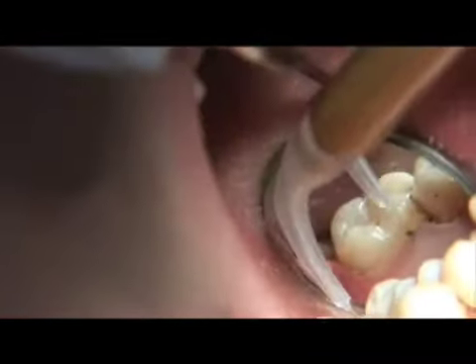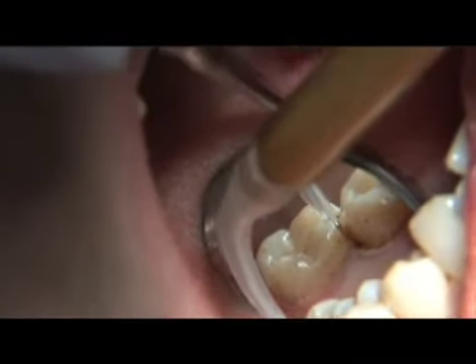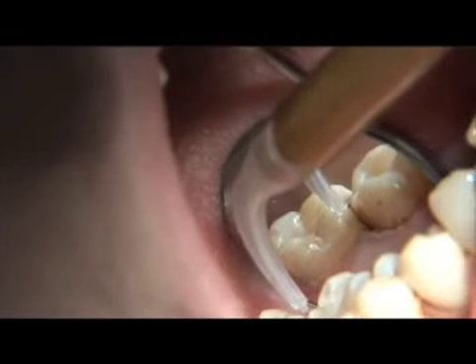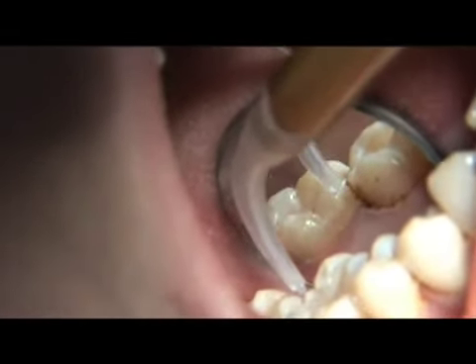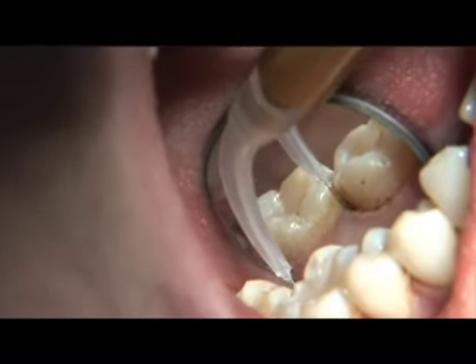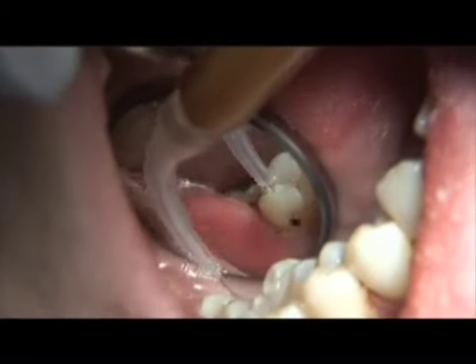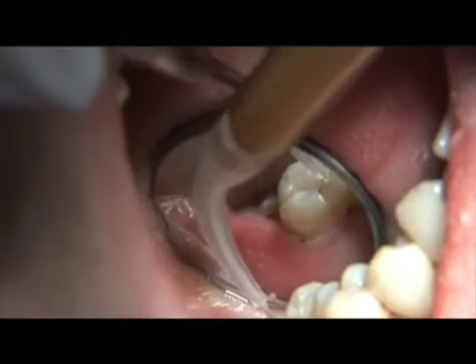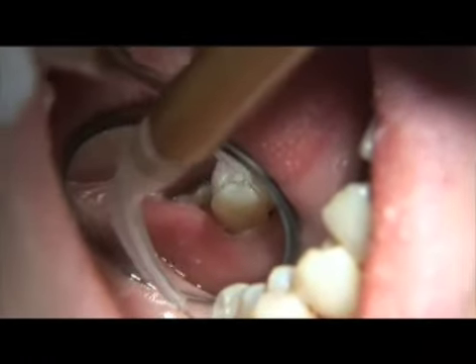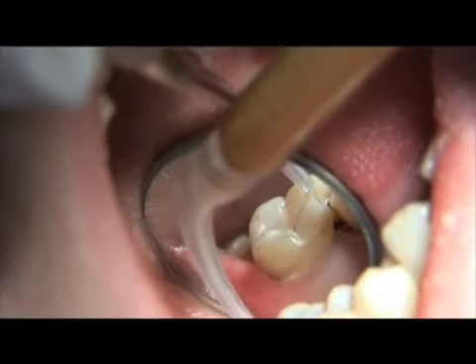Laser curettage will take up to 10 minutes per quad of the periodontal therapy appointment. It will take 30 to 45 minutes if one is doing the entire mouth at one appointment. Because the laser fiber is so small, treatment access is made easy, even in the most challenging areas of the mouth. Be sure to provide proper oral hygiene and post-operative instructions. Pain medication is rarely indicated for laser periodontal therapy.